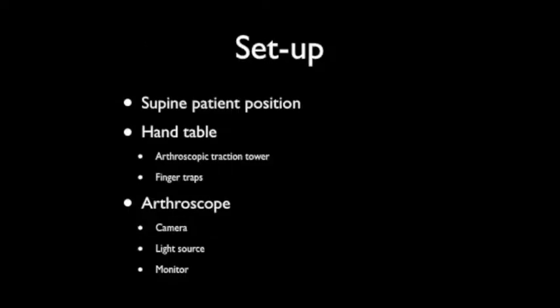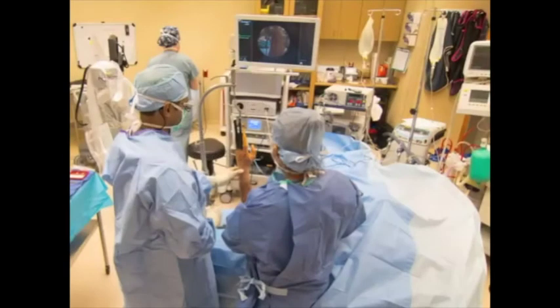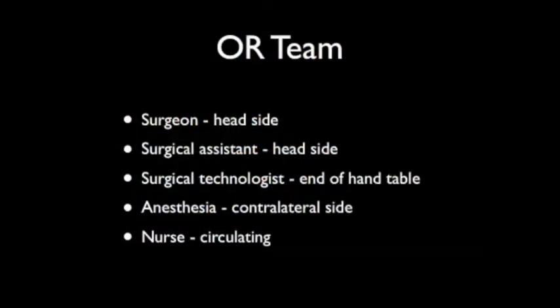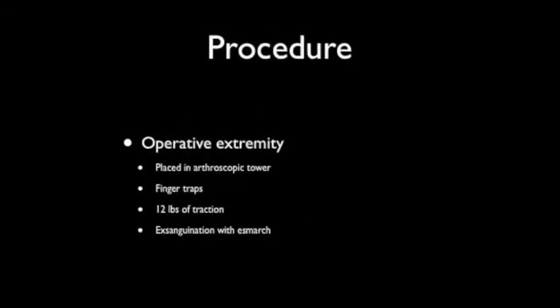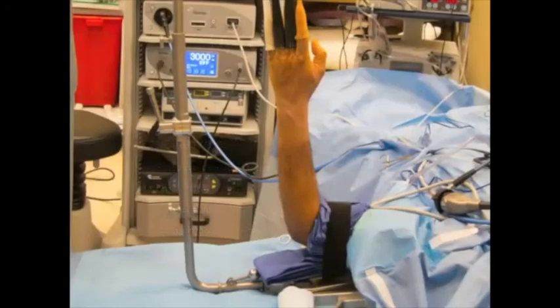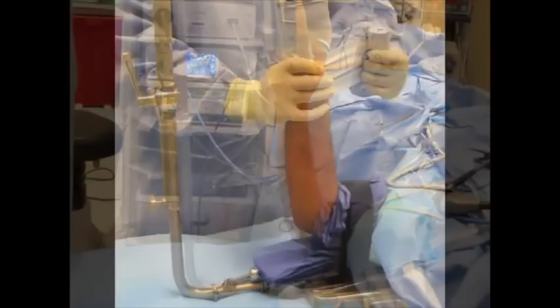To perform the procedure, the patient is placed in the supine position. After general anesthesia is established, the equipment and operative team are assembled around the patient, including a hand table and arthroscopic traction tower. The operative extremity is placed in the arthroscopic tower using finger traps and 12 pounds of traction is applied. The extremity is exsanguinated with an esmarch.